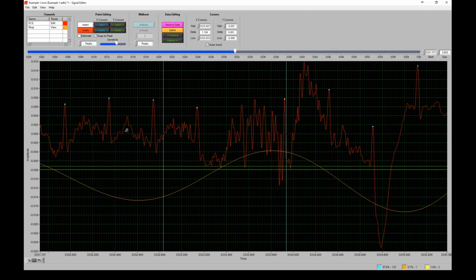And so we have another example here of really being unable to identify where in this noise the ECG signal is buried, where our QRS complex is. And so in this situation, again, we want to do a midbeat. I would simply move these blue cursors so that they're on the outside of the known good beats, hit the midbeat button, and we can see that timing is restored. And now we've midbeated a total of 2 beats, which accounts for 1.4% of our total point distribution. Totally acceptable, well under that 10% threshold. And we can be confident then in using these values.